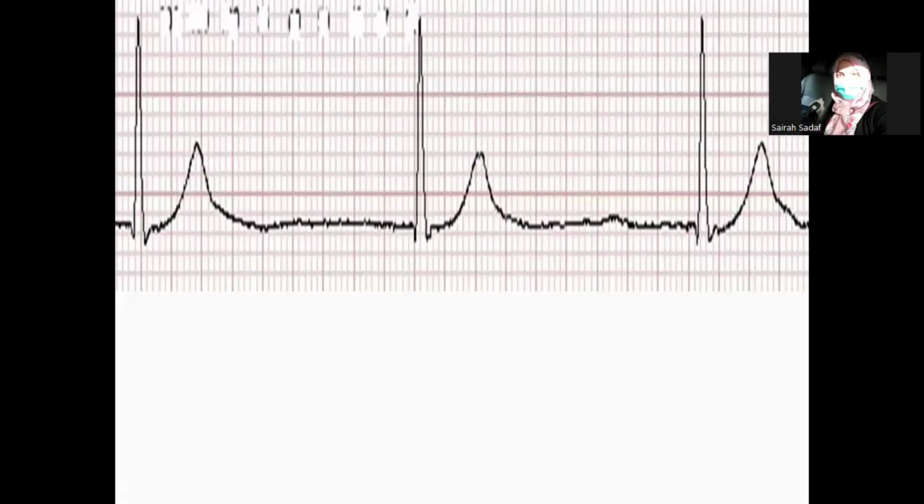Now, I have some hands-on or interactive slides for you. Ali Hassan is saying 33, Jennifer is saying 33, and Ali is saying 30. Anyone else? Safiyullah 30, 32, Dr. Khizr 33. All right, so your answer is 33. Asma is saying 33. Let's check the answer. Yes, it's 33. Good. So you know how to do it.